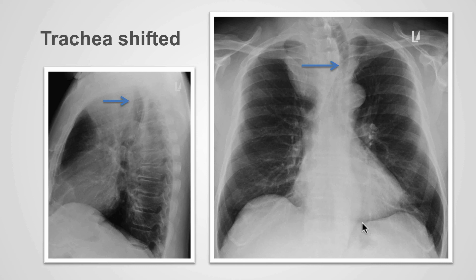The trachea can be displaced by pathology involving the mediastinum or the hila. In this example, there is an anterior mediastinal mass that is displacing the trachea to the left and narrowing the caliber of the trachea. The trachea is also displaced posteriorly, and this posterior displacement is best seen on the lateral x-ray.